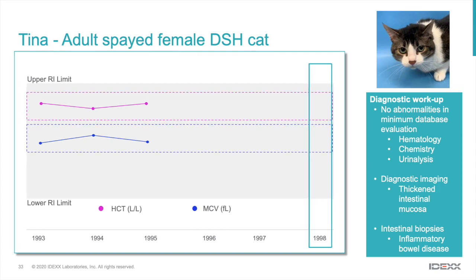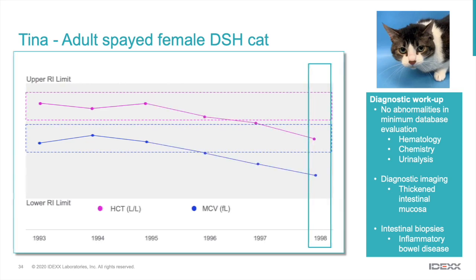And I'm going to limit it to these two parameters to make it simple and visual for you. Let's first develop the driving lanes for these two parameters. Clearly, you need several points to develop these arbitrary driving lanes. However, based on the first 3 years worth of data, I feel pretty good about the lanes that I've drawn. After filling in the rest of the graph, we make several observations.